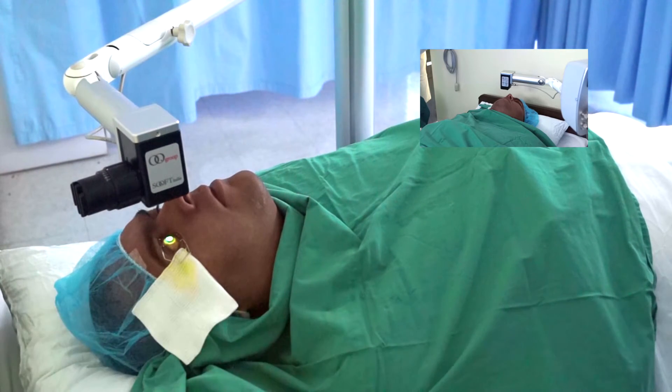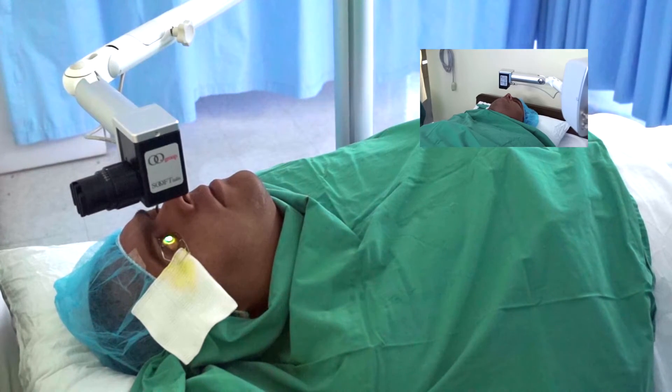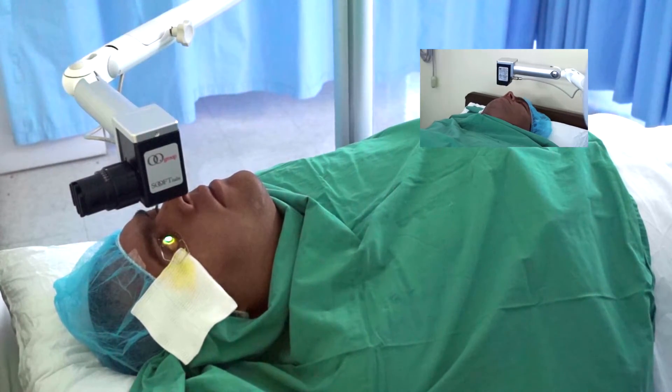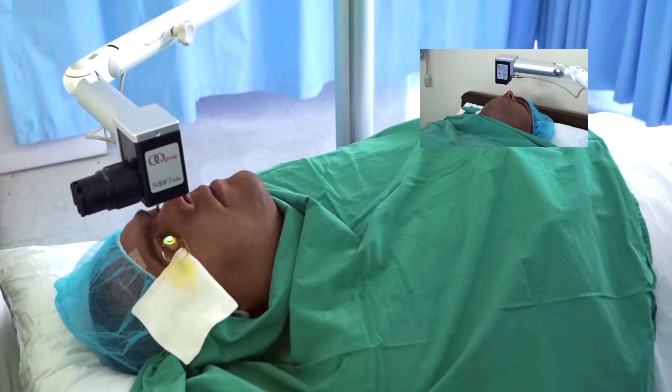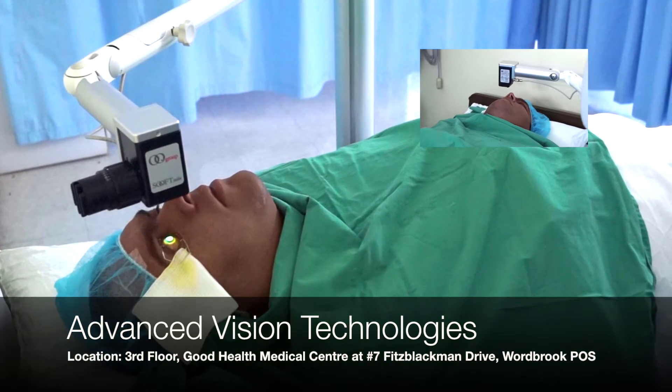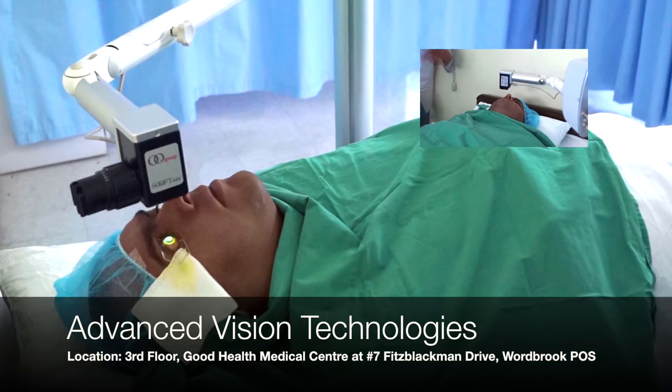This procedure is pain-free. Unlike the epi-off method, where the actual cornea is scraped with a blade, it is not painful. Whereas the epi-off method requires light to be shown onto the cornea for over 30 minutes, this procedure takes just 9 minutes of UV light.